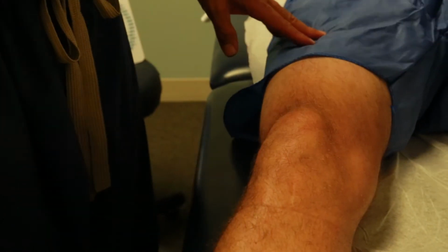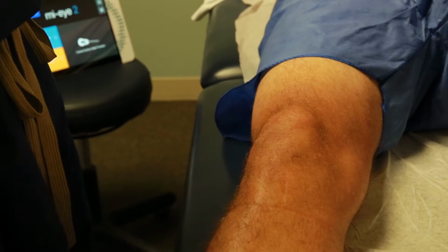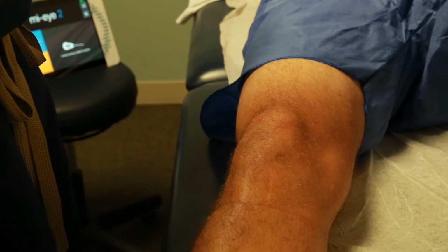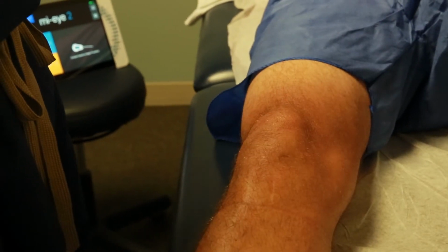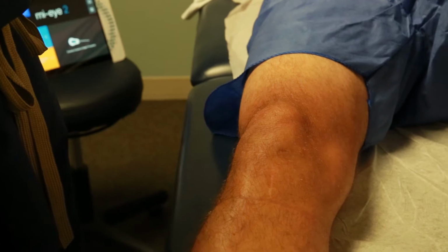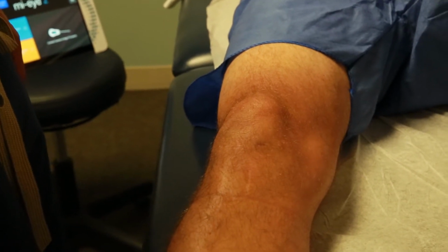So the first thing you want to do is just have the patient lie on his back. If you want to put his head up a little bit, he can. If the patient wants to watch, it's not a problem. If they don't want to watch, it's not a problem. They have an option to watch the screen alone or just watch nothing. Our patient here has decided he doesn't want to watch anything, just wants to relax, so he's lying flat on his back with his head on a pillow.